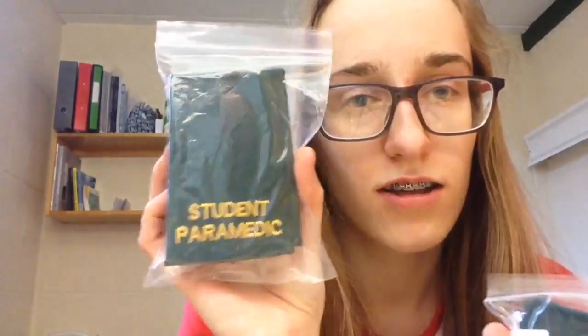I thought I'd order it all at once to save on postage. The main thing is this stethoscope — I've been wanting it for so long, so I'll open it last. First though, how exciting are these student paramedic epaulette slides! I've got two sets. I looked on eBay and they were like 10 to 15 pounds each, so I got two sets for 10. I got two sets because I'm buying a shell jacket which has epaulette holders on it.